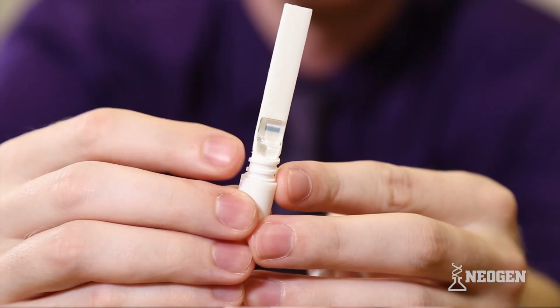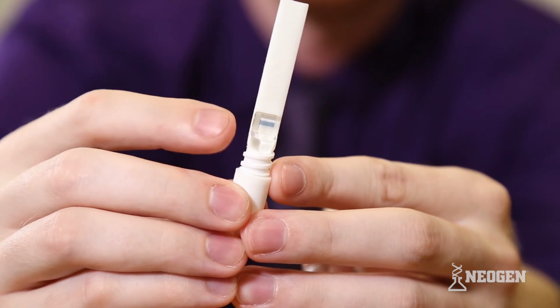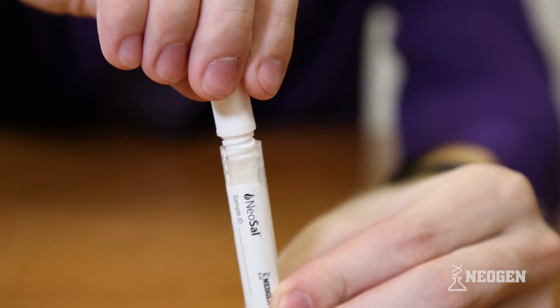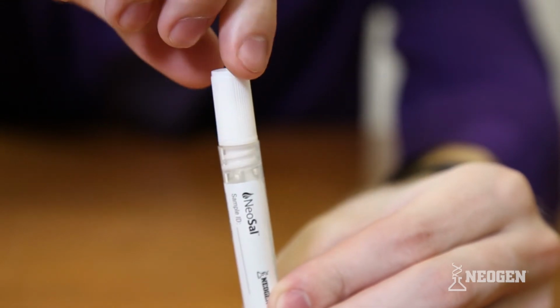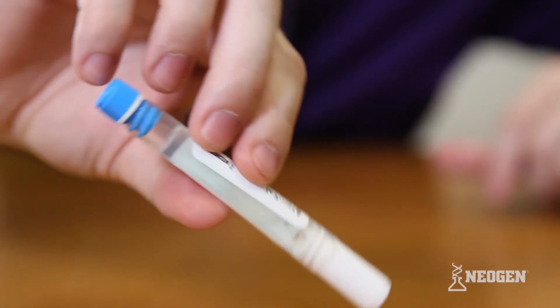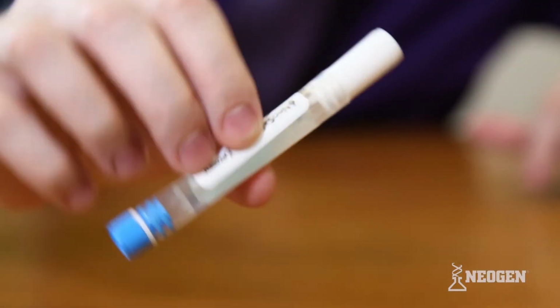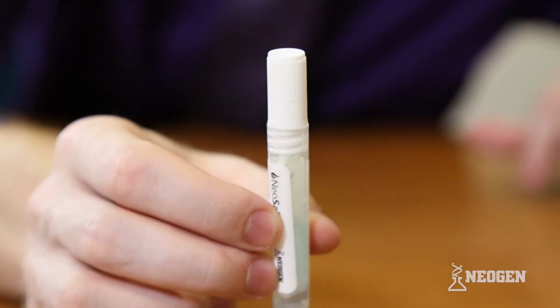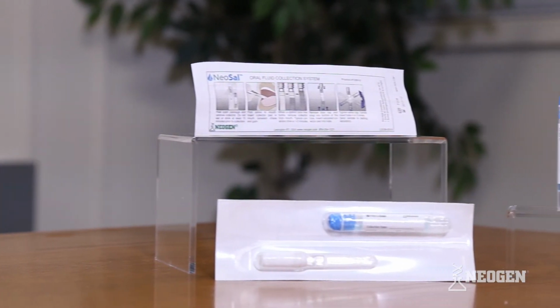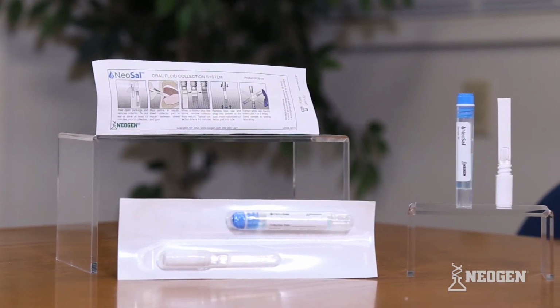10. Once the SVAI forms a distinct blue line across the clear plastic window, instruct the donor to remove the collection pad from their mouth. The collection pad should then be inserted into the buffer tube. The donor should twist the white handle tightly into the buffer tube to secure. Once the collection pad is secured into the buffer tube, the donor should gently invert the tube 4 to 5 times to thoroughly distribute the buffer solution onto the collection pad. The sample is now ready for shipment to the testing laboratory. The sample can be stored at room temperature prior to shipping to the laboratory.